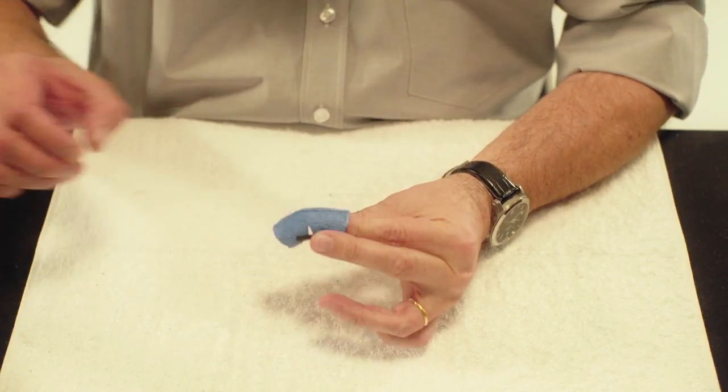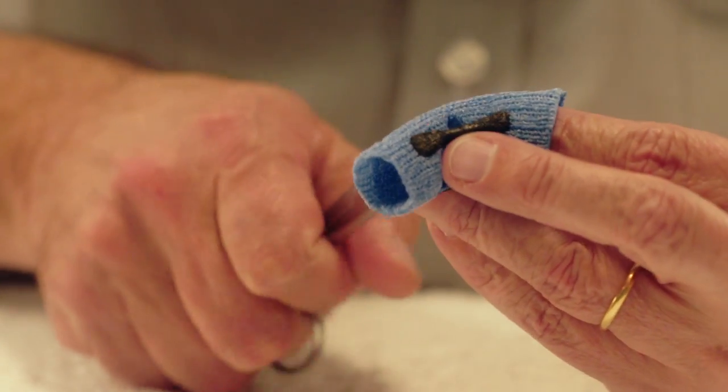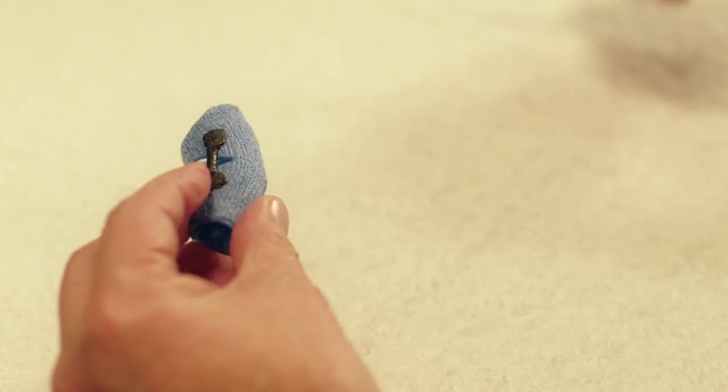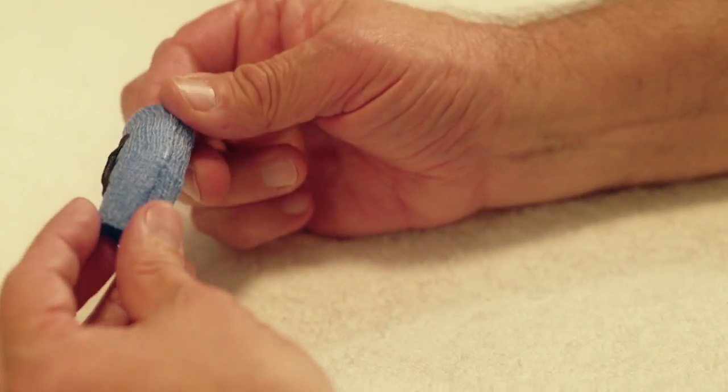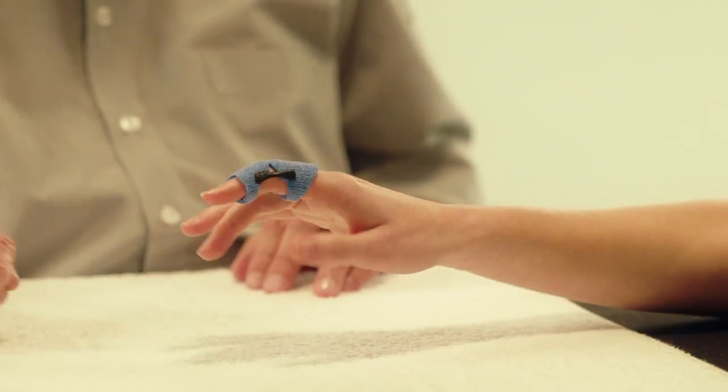Finally, cut the finger base of the orthosis in two by cutting from the tip of one lateral V over the dorsal side to the tip of the other V, thus enabling flexion. Try the orthosis on the patient and check the fit.